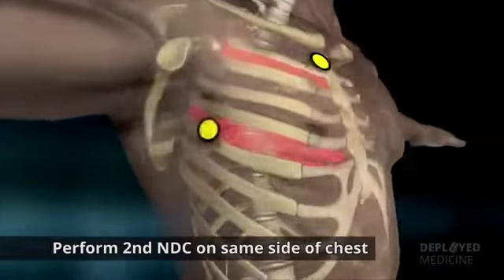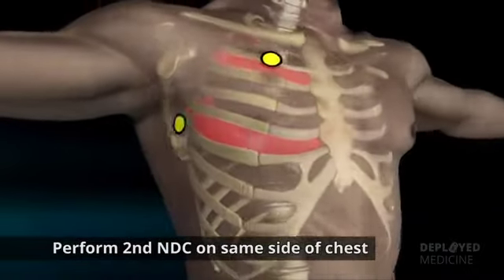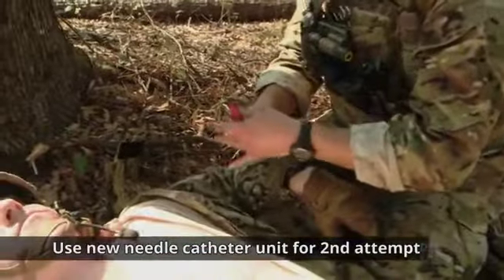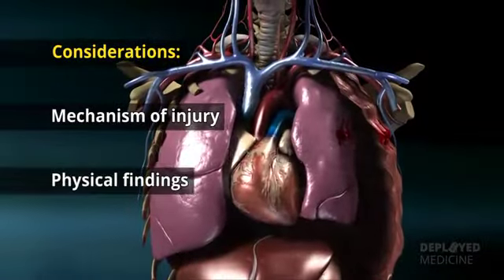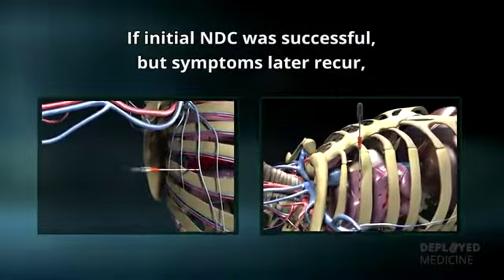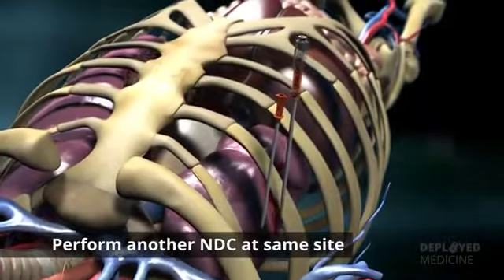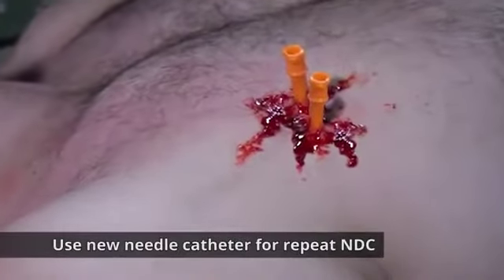If the initial NDC fails to improve the casualty's signs or symptoms from the suspected tension pneumothorax, perform a second NDC on the same side of the chest at whichever of the two recommended sites was not previously used. Use a new needle catheter unit for the second attempt. Consider, based on the mechanism of injury and physical findings, whether decompression of the opposite side of the chest may be needed. If the initial NDC was successful but symptoms later recur, perform another NDC at the same site that was used previously. Use a new needle catheter unit for the repeat NDC.